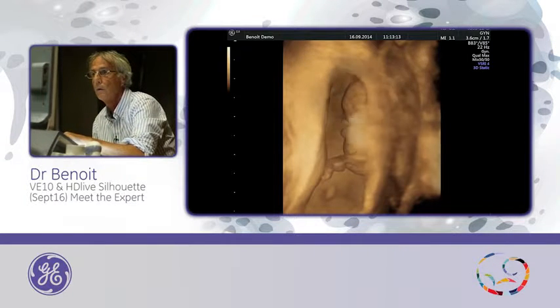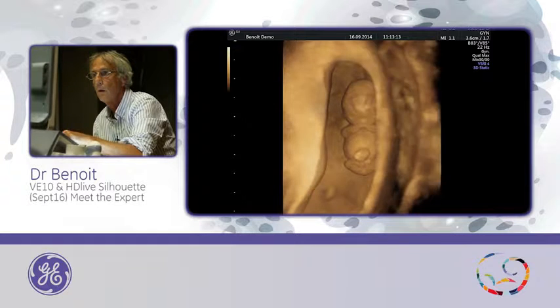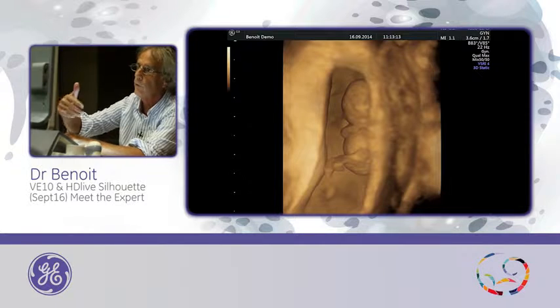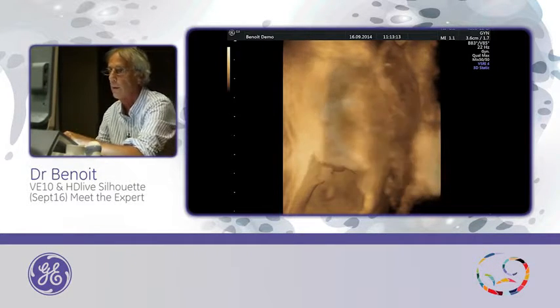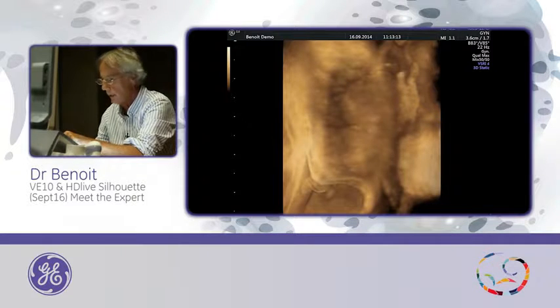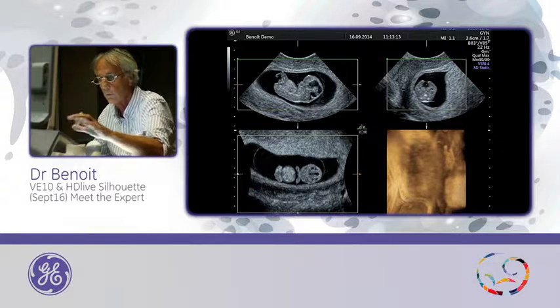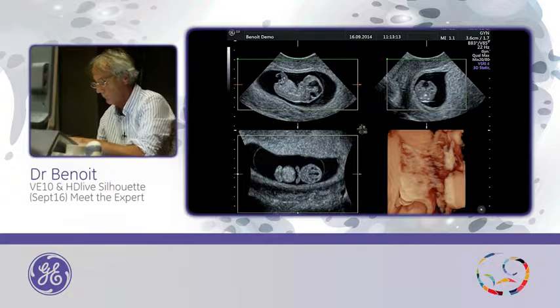And you have to move inside. And here, this is the embryo. But if you want to use it with a classic surface mode, you have to move inside or you have to use magic cut to cut around. And with the new HD Life, it's easier because you can start with HD Life here.